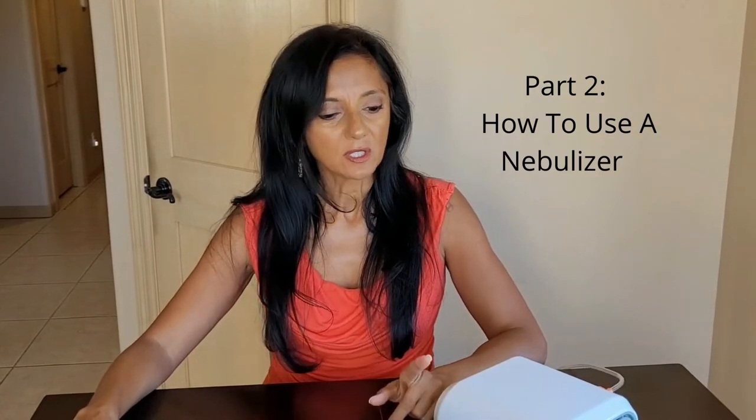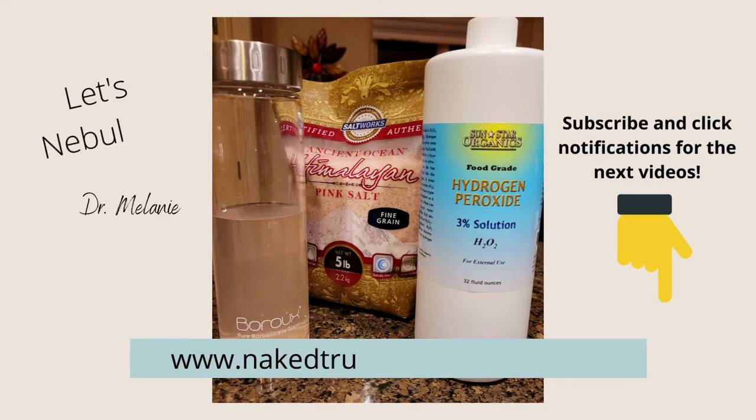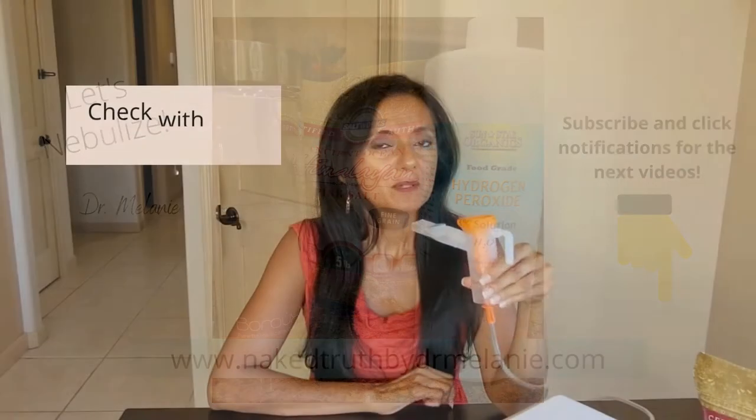I want to show you how to breathe in and out of your nebulizer. Please do not forget to check with your medical physician before doing any inhalation therapy, especially when you're mixing your own solution for the nebulizer.